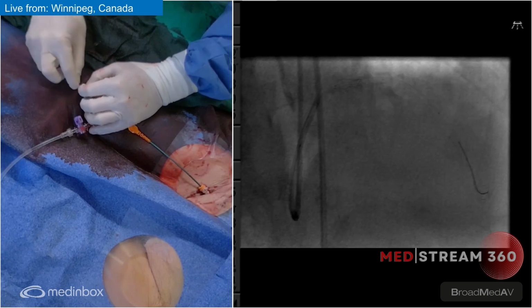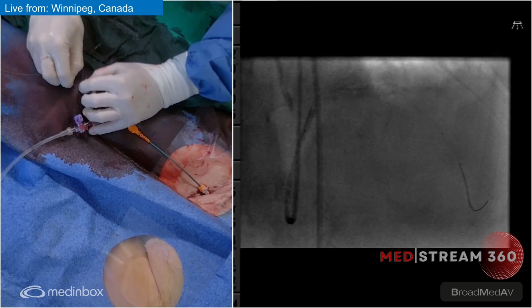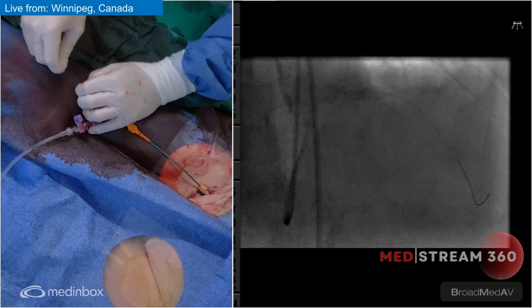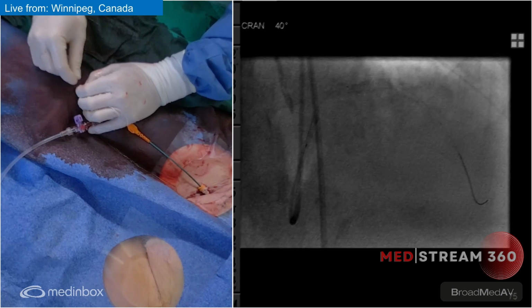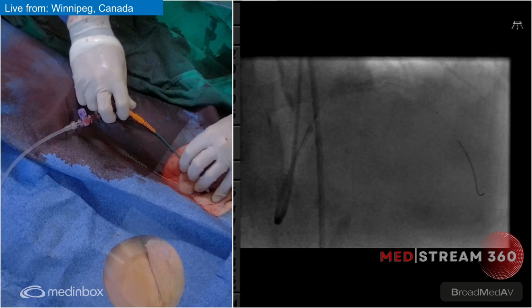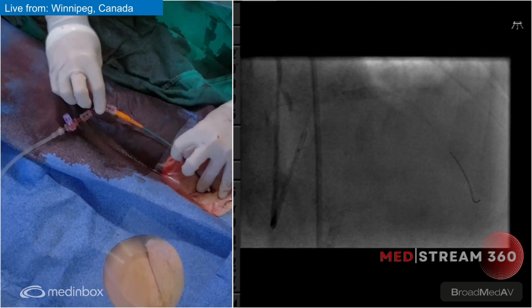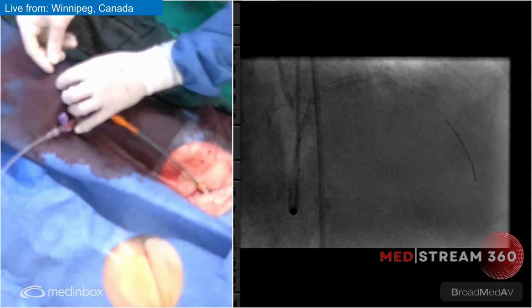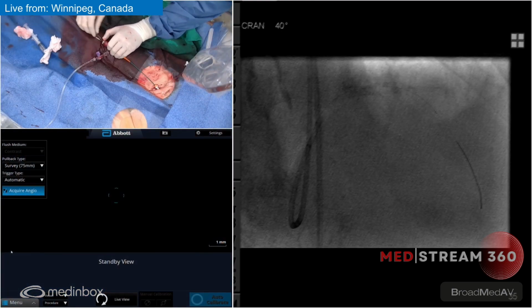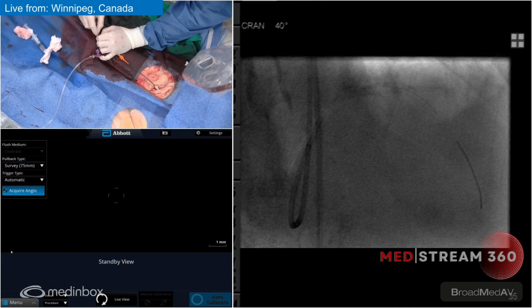Let's see if I can change the angle of the guide, maybe. Pull it up and clock it. Looking good. Let it free fall a little bit. No, it just buckles more. Looped in the aorta. Let's go back in and try this part. Yeah, open up the. Oh, I got it. Here you go, Jim. I'll give you this again.